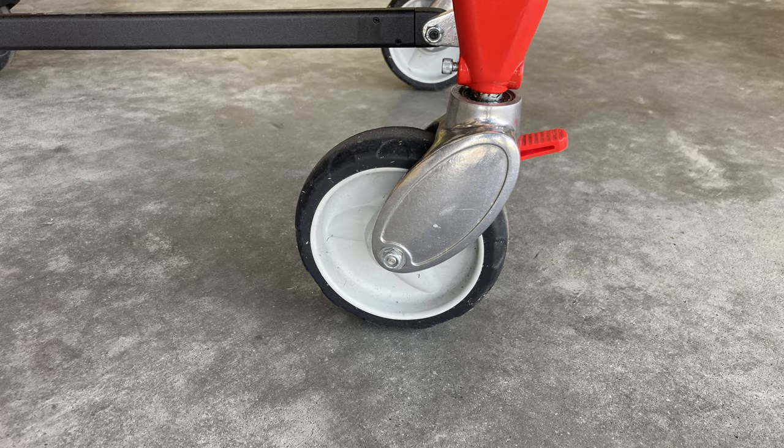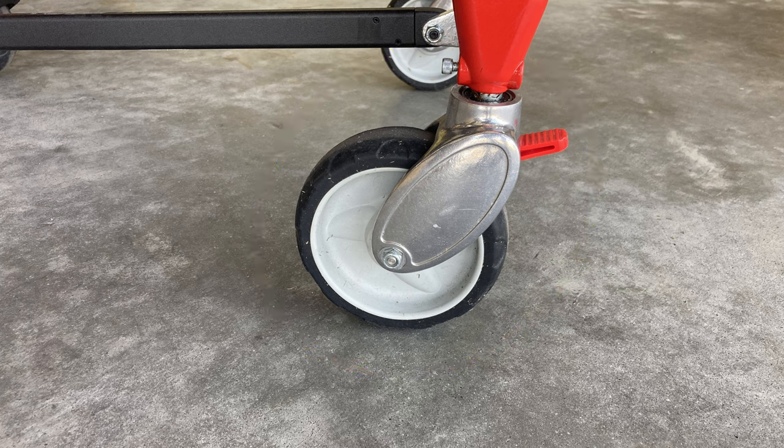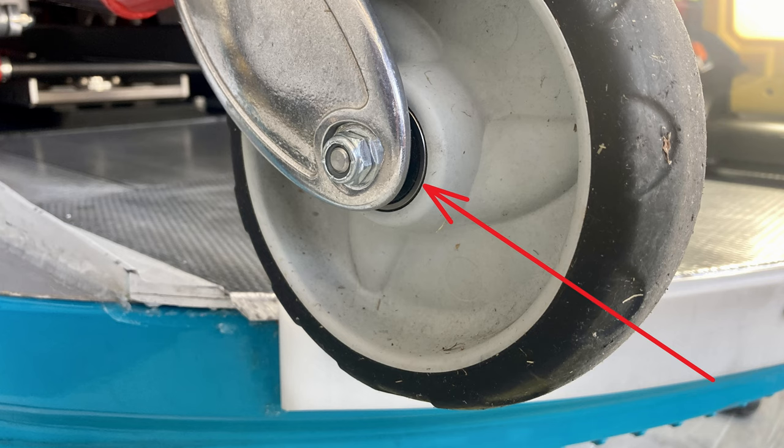When you first get the 28A1, go ahead and order two of these locking wheels. If crew members aren't used to the wheels locking and they push it anyway, it will grind a flat spot on the wheel — then it'll be like a bad shopping cart, bump bump bump. Also, the wheel hubs are made of plastic but the bearing is steel, so over time the plastic will develop hairline cracks around the bearing. Keep an eye on that at your hundred-hour inspection.